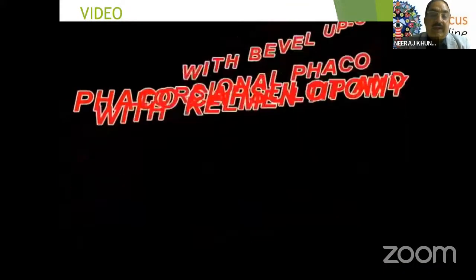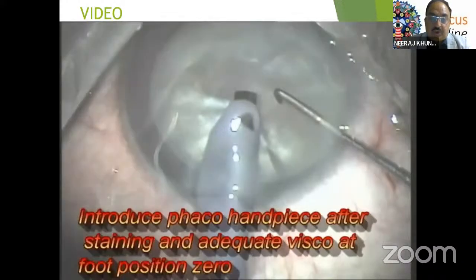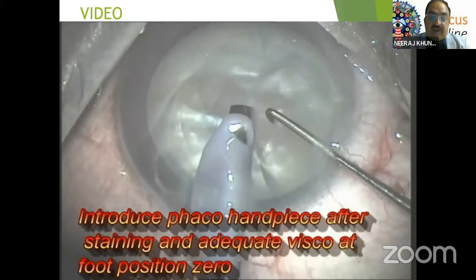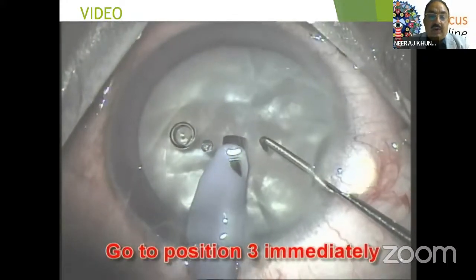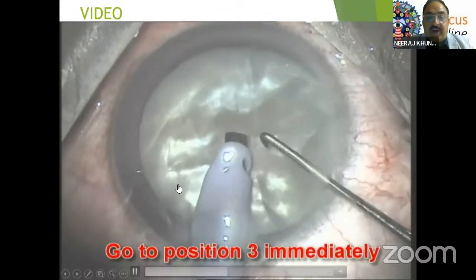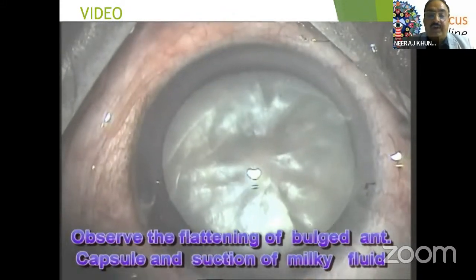Second technique is phacoemulsification. The settings are phaco only, torsional 80% fixed, vacuum 150, flow rate 28, and enter after injecting higher order visco with foot position 0. Now introduce the phaco handpiece after staining and adequate visco. Go directly to position 3. Just appreciate that the fluid is getting sucked and the positive intralenticular pressure is gone.